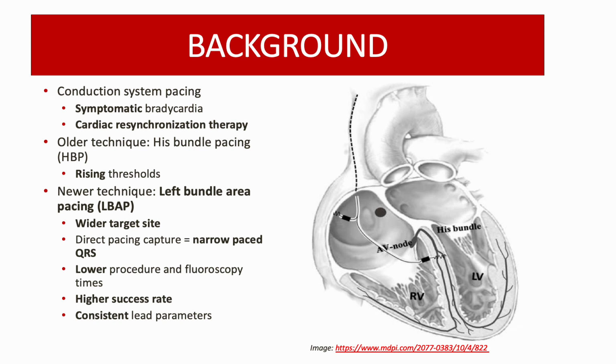This is a technique that involves implanting permanent pacing leads along different sites of the cardiac conduction system, which is outlined with my highlighter here. Conduction system pacing has been rapidly gaining popularity for treating patients with symptomatic bradycardia and for patients requiring cardiac resynchronization therapy. His bundle pacing is an older pacing technique, which is now replaced with left bundle area pacing. Left bundle area pacing is a much more popular technique now because of its high success rates.